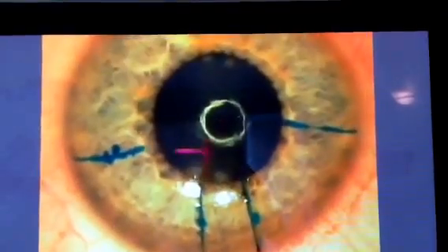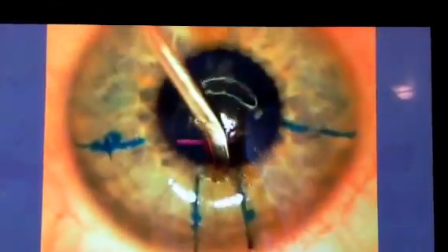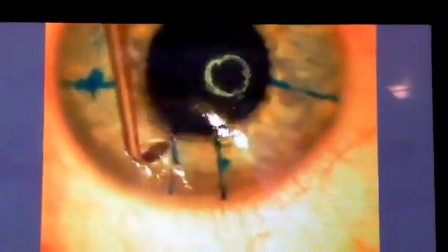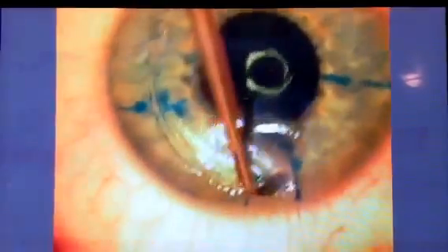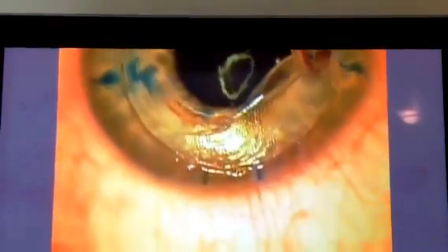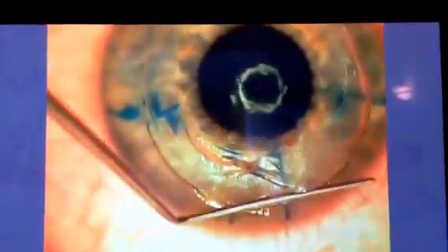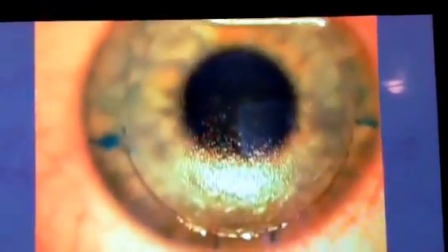That's just a corneal marker — you probably know that. And it just comes off that easy? It does. He obviously marked it ahead of time. Some of the edges get a little hard. You can see he's kind of working it a little bit. But he just takes it and he lifts it. Cool, huh? Yeah, that is cool.